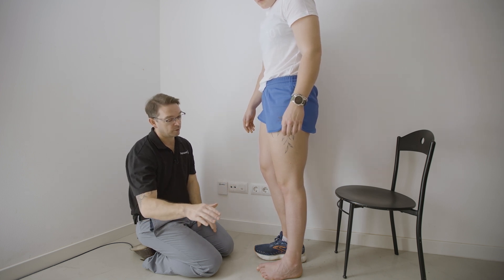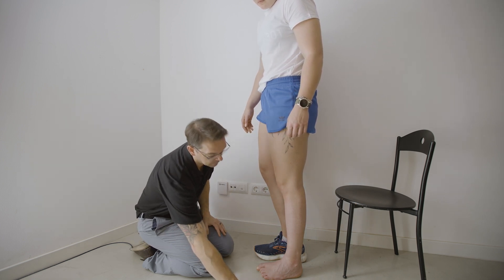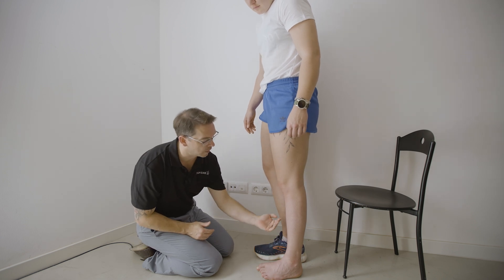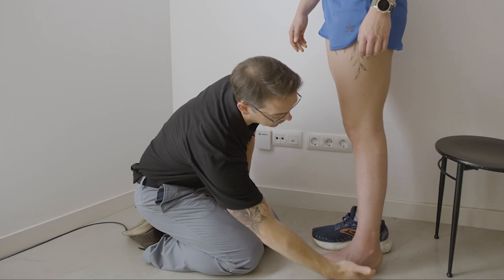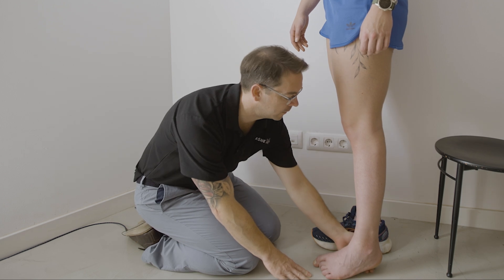The shape of the underside of the brace will mirror your shoe, which is why I have done this. If for whatever reason your heel came off the ground, I would need to accommodate the pitch block to mirror the position of your foot — in that instance I would probably have to raise it up to accommodate that.